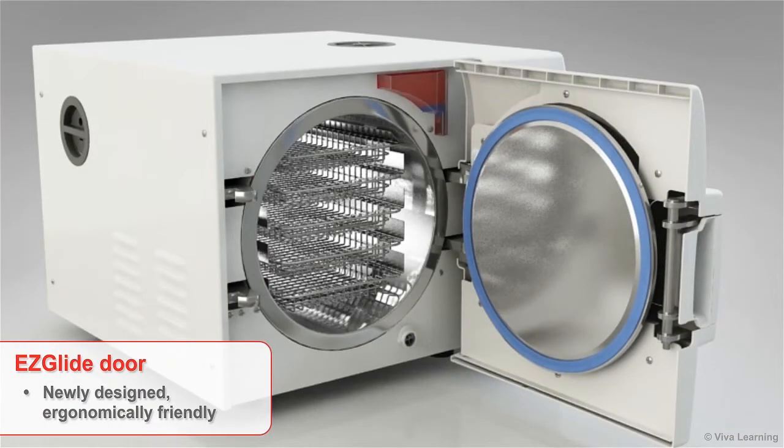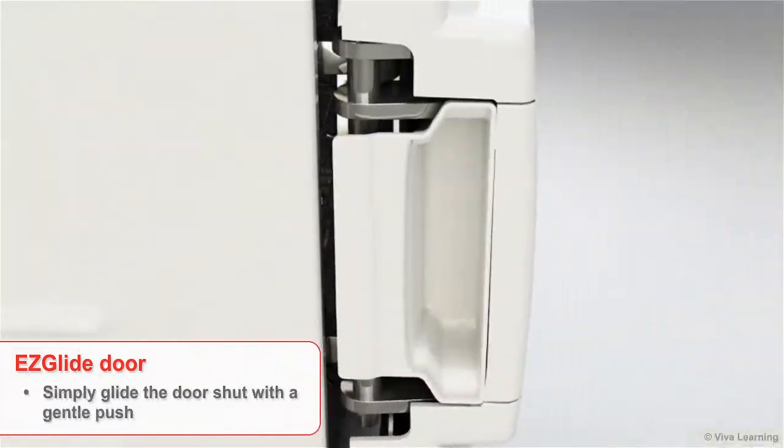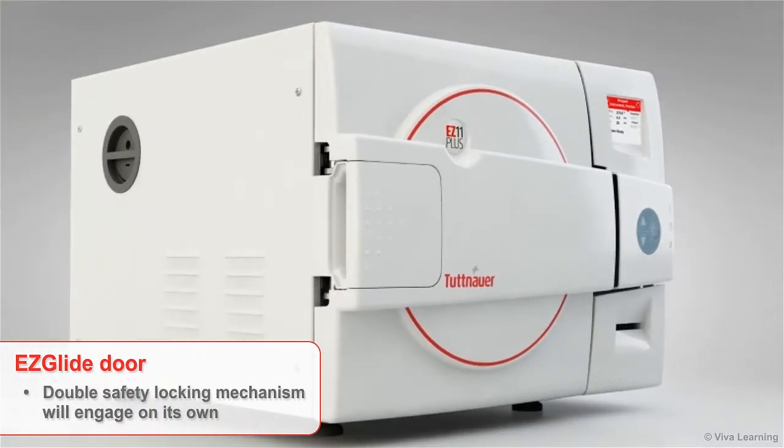The newly designed ergonomically-friendly EZ Glide door provides effortless opening, closing, and locking. Simply glide the door shut with a gentle push and the double-safety locking mechanism will engage on its own.